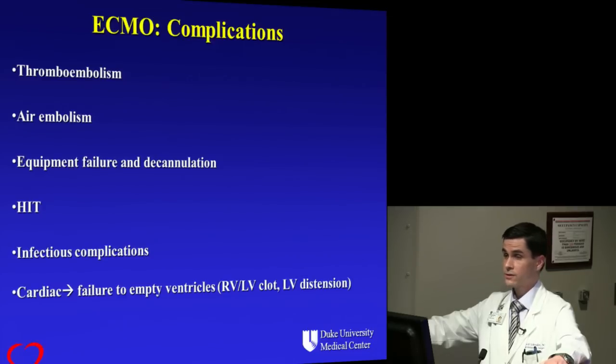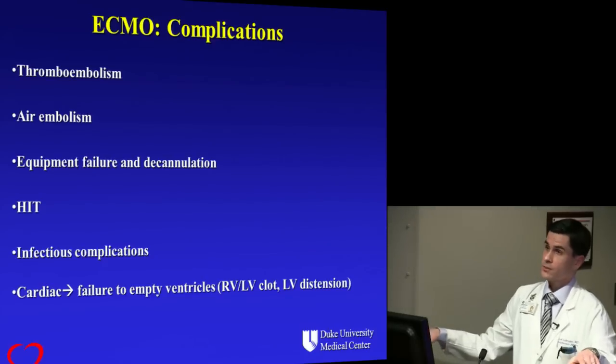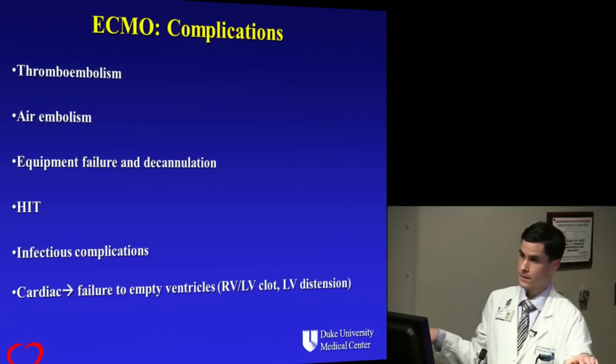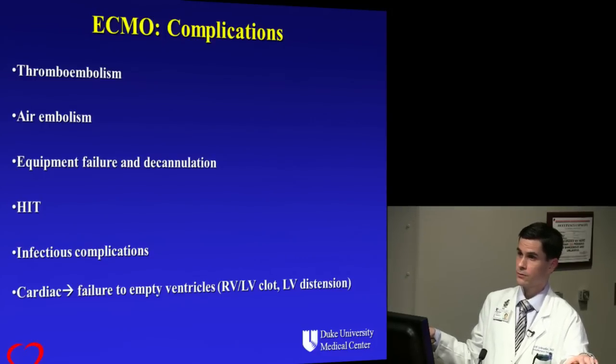Infectious complications, they increase with the urgency of the procedure and emergency. You have two cannulas in the groin, which we call a sterile procedure, but oftentimes, frankly, it's not, so we have to be very vigilant for infectious complications.